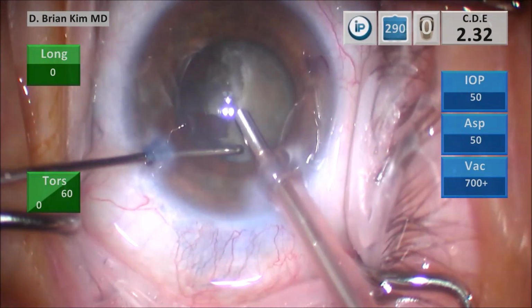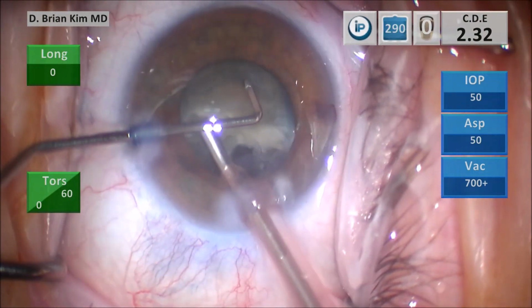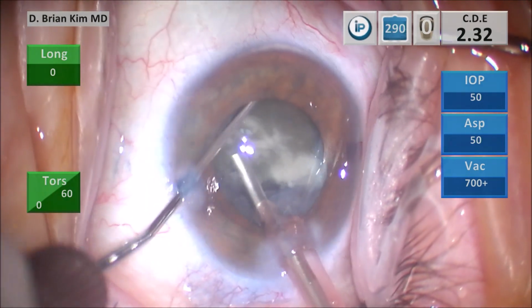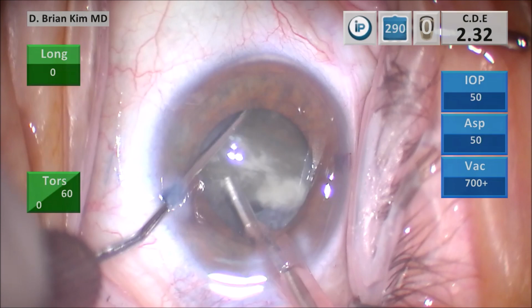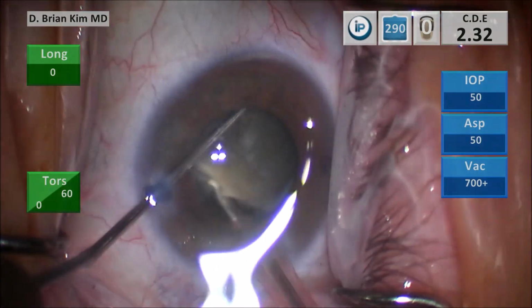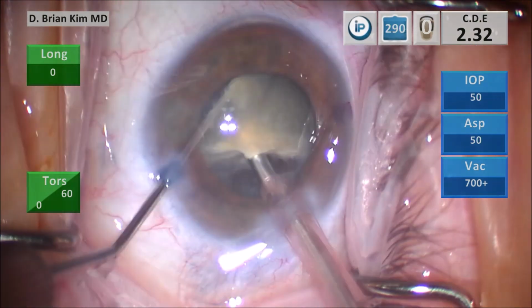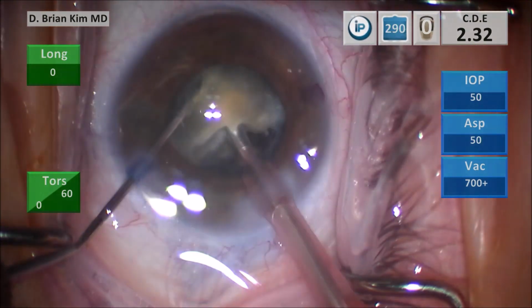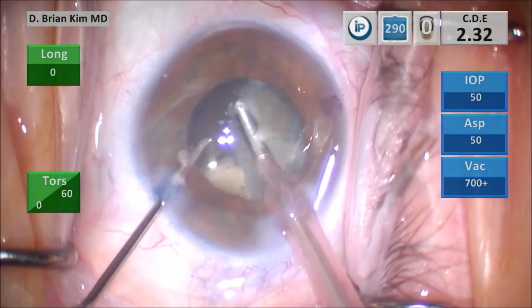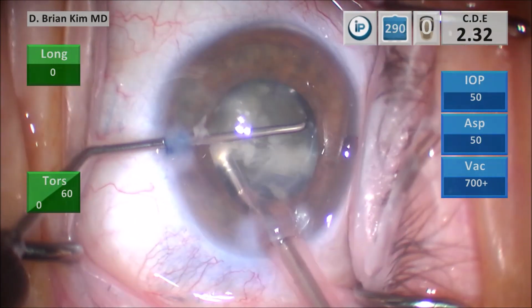I'm going to rotate the second heminucleus in front of me, place the chopper around the lens piece, making sure I'm definitely underneath the rhexis edge, placing the fingertip deep. I'm not quite around it, so I go again, making sure I can feel the lens between my instruments. Now I do. Now I bring them together. I'm crushing the lens now, and then I start to spread my instruments. And by doing so very carefully, I'm able to separate those deep adhesions.